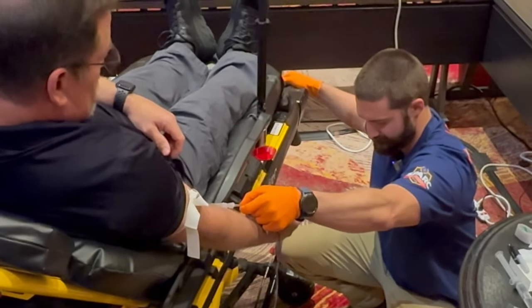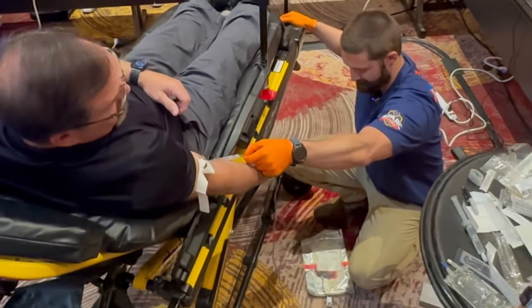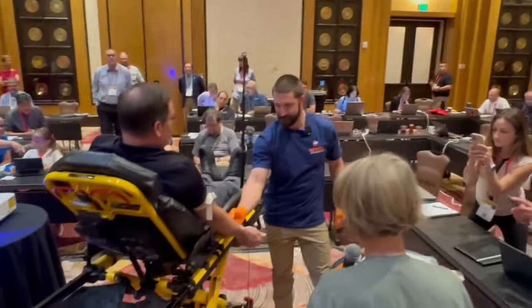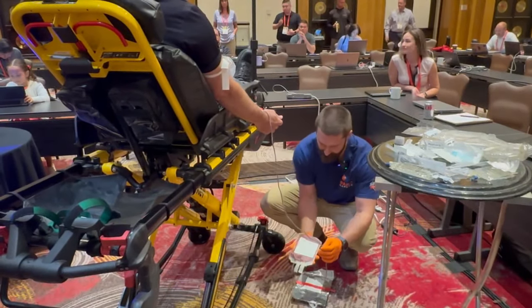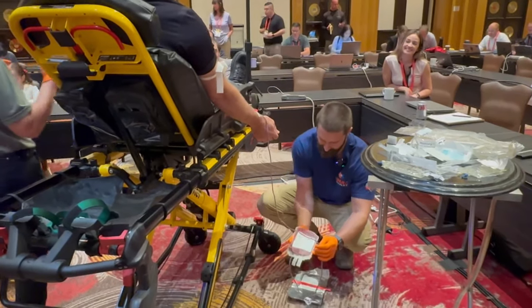There are field expedient methods for guys like Alex when they're out humping gear. We now have some good flow — we just had to do a little bit of adjustment. This is going to take a few minutes for the bag to fill. As fascinating as it is to watch, it's a bit like watching paint dry for about 10 minutes.